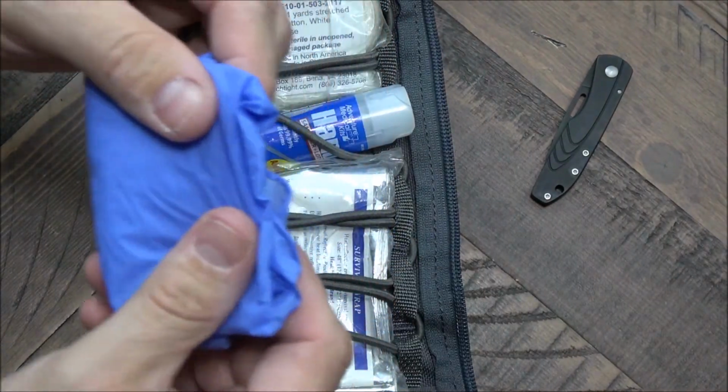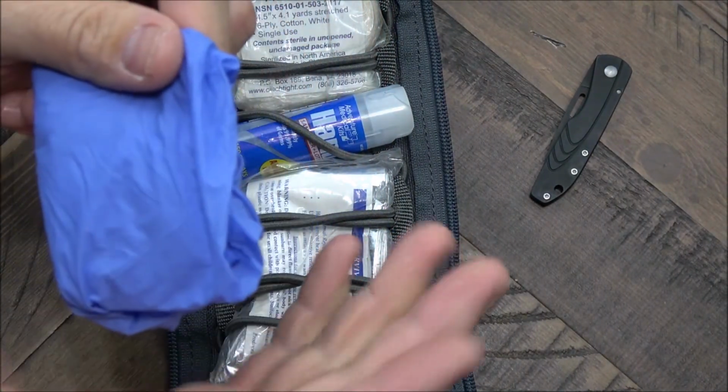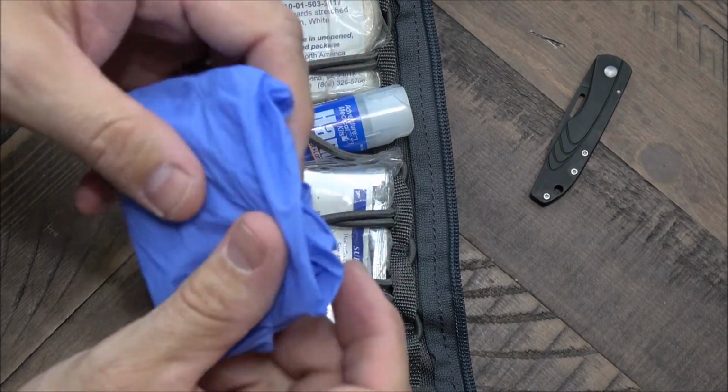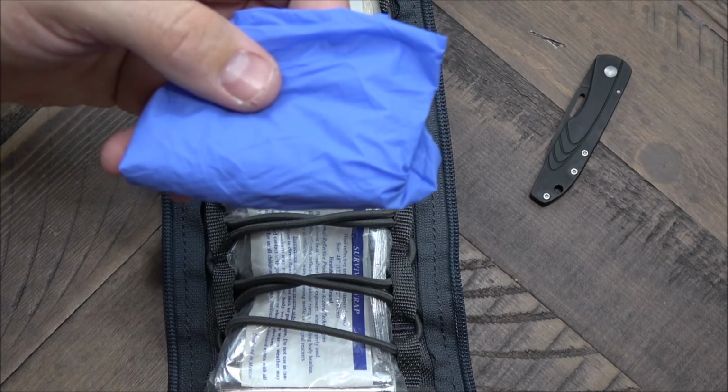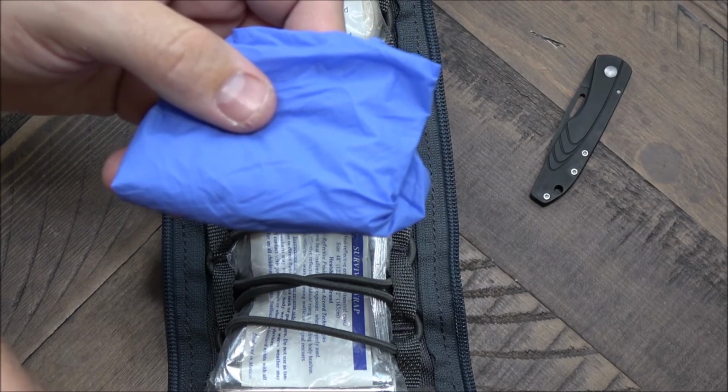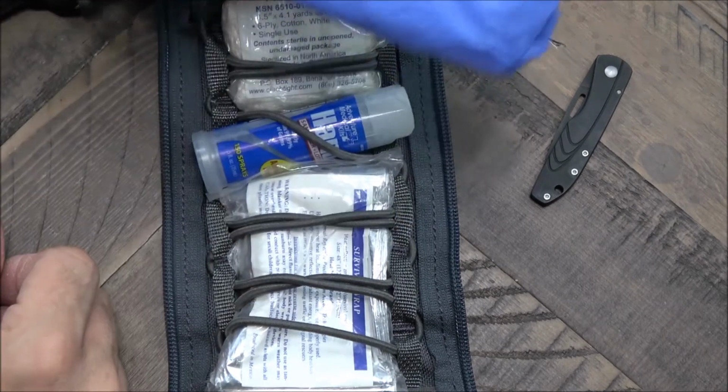The way that I keep my gloves folded is so that when I grab them, I'm grabbing two pairs. I'm grabbing a complete set of gloves. They stay together, so if I need to toss these to somebody else to come in and assist me with the patient, they can do so.